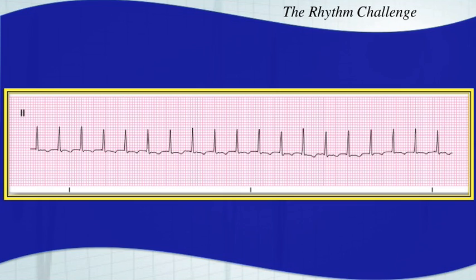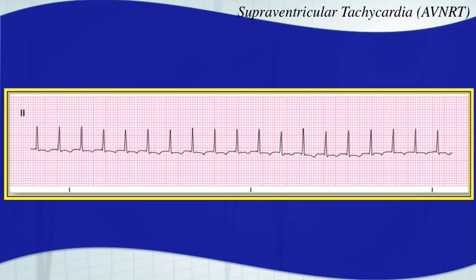This is a supraventricular tachycardia. More specifically, this is AV nodal reentry tachycardia. You can't see any obvious atrial activity. Very narrow QRS complexes, and very fast, and very regular. All of those fit SVT.